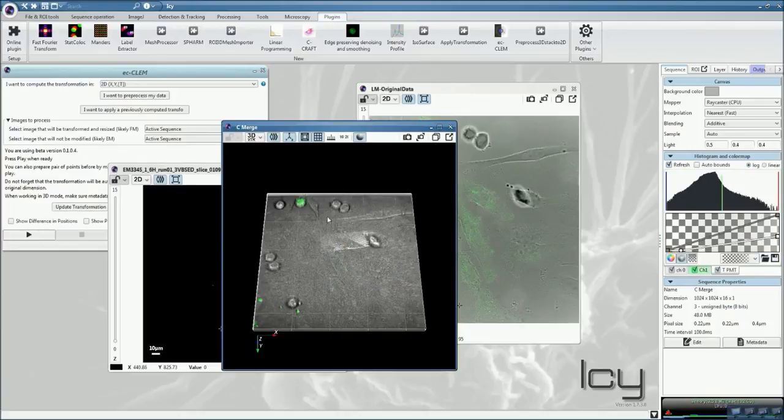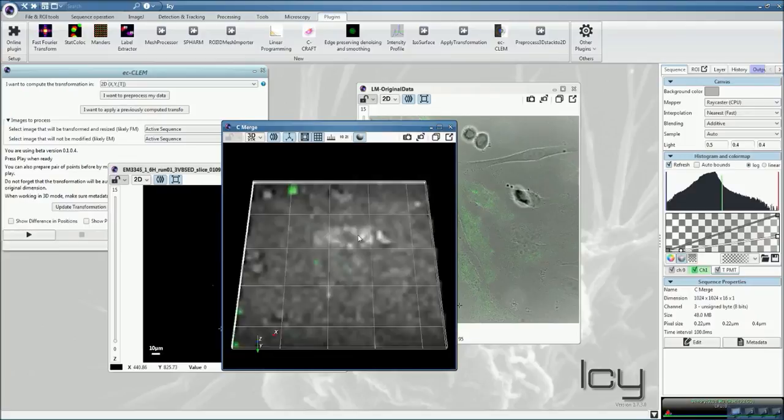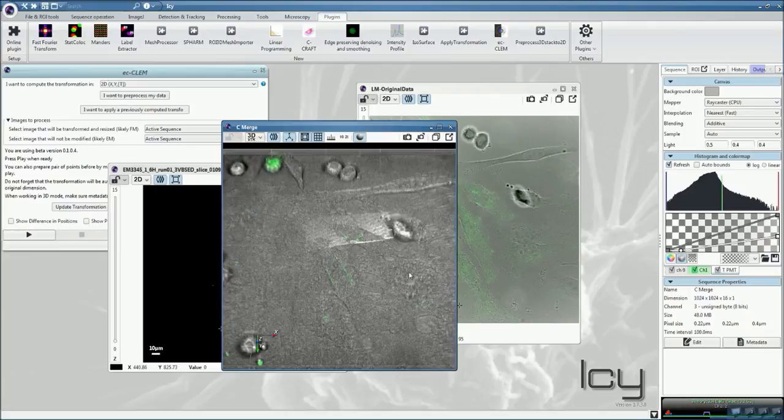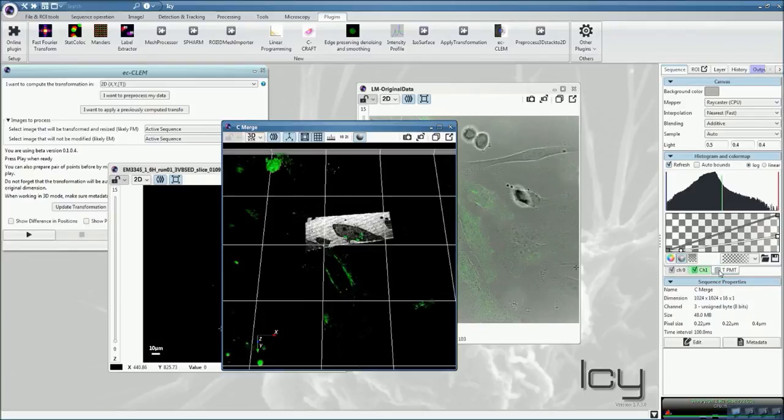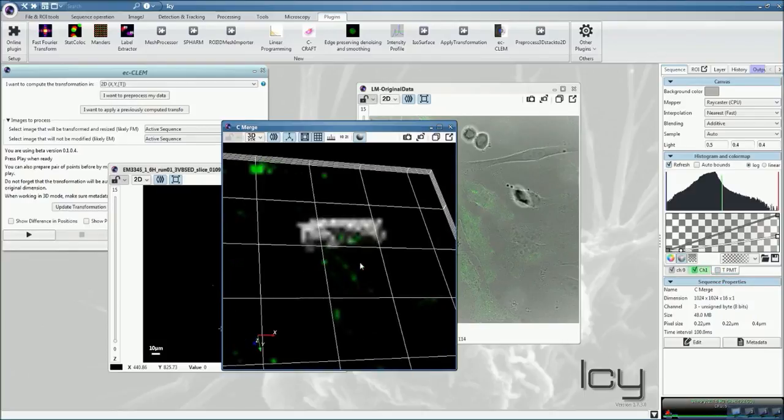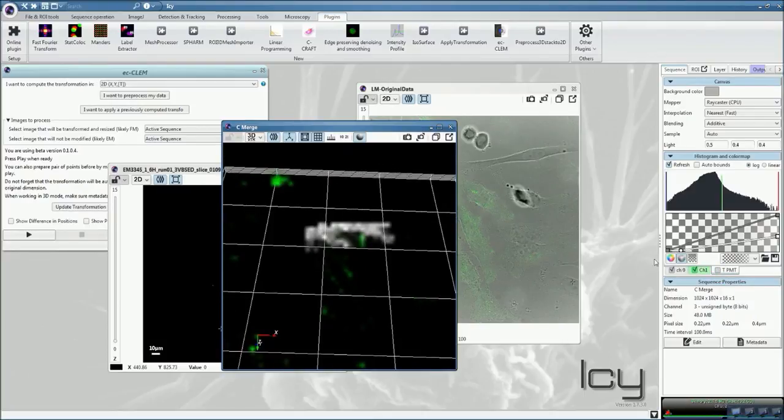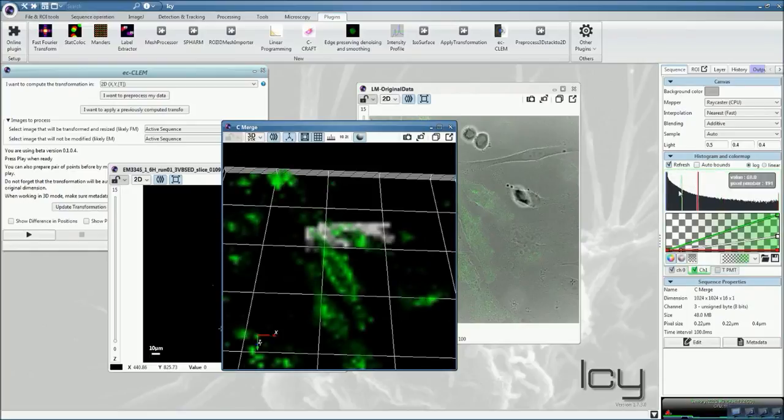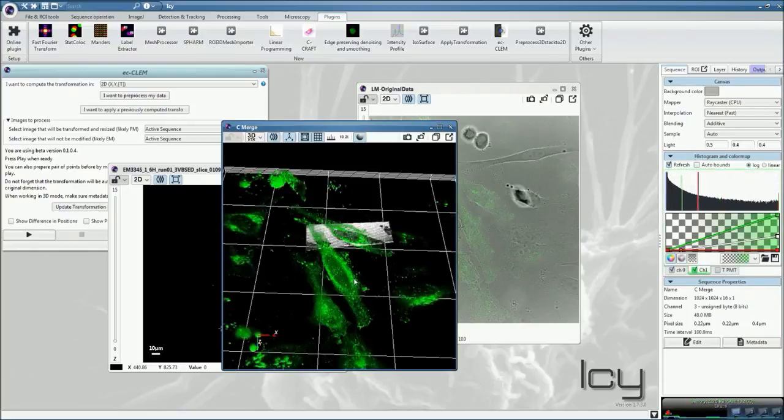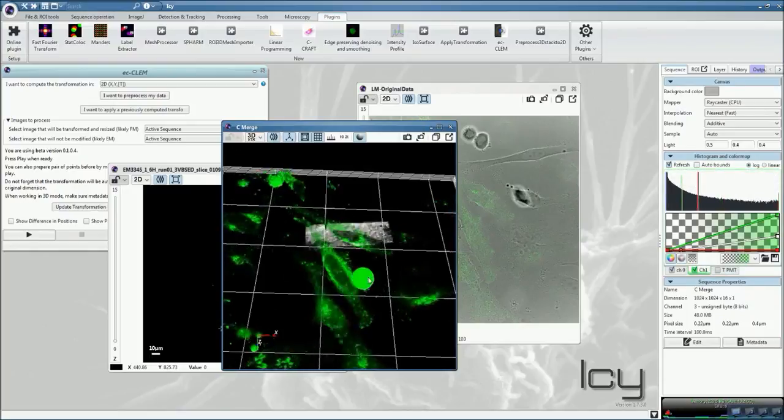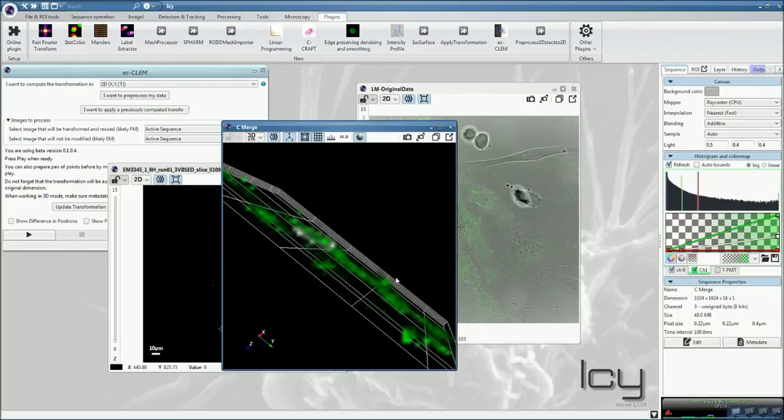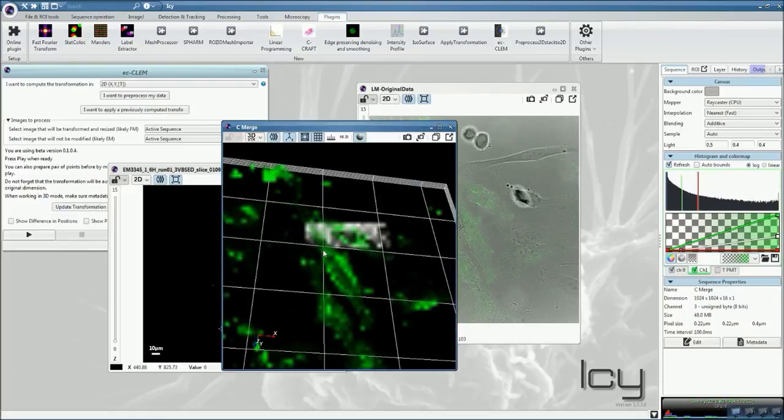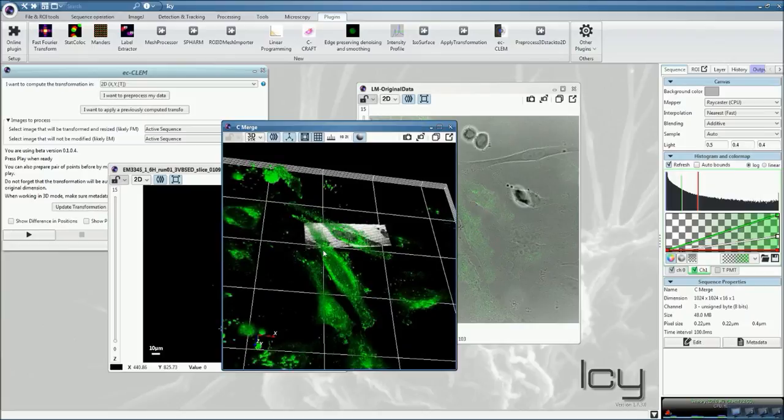So now you have your 3D fluorescence stack containing your EM section. Here we have the display of all channels. If we just remove the transmitted light, we see that our electron micrograph is now fitting inside the fluorescence stack. We can adjust the fluorescence at our convenience, and we can look at how the section is oriented into the bulk.